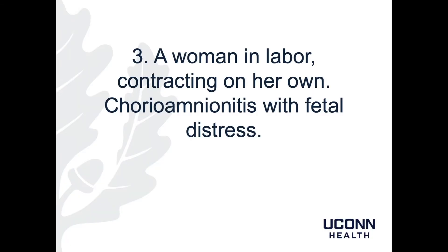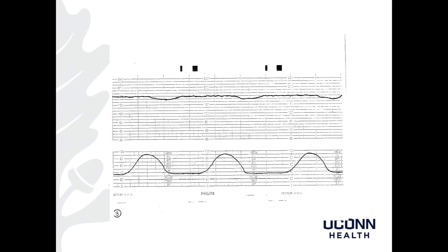Case 3 is a woman in labor contracting on her own. There is chorioamnionitis — an infection of the amniotic fluid and membranes — with fetal distress. My read: fetal heart rate baseline of 180s, minimal variability, no accelerations, positive recurrent late decelerations. That would make this Category 2 to 3. In the setting of chorioamnionitis there is usually a fever and maternal tachycardia. The baby will also have tachycardia, and these recurrent late decelerations tell us that the infection is starting to interfere with oxygen exchange through the placenta. This baby will either need to deliver vaginally very soon or a C-section would be required.